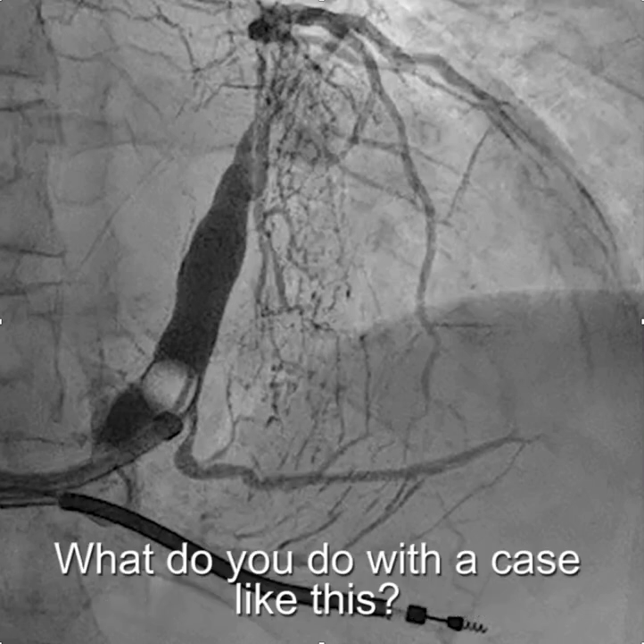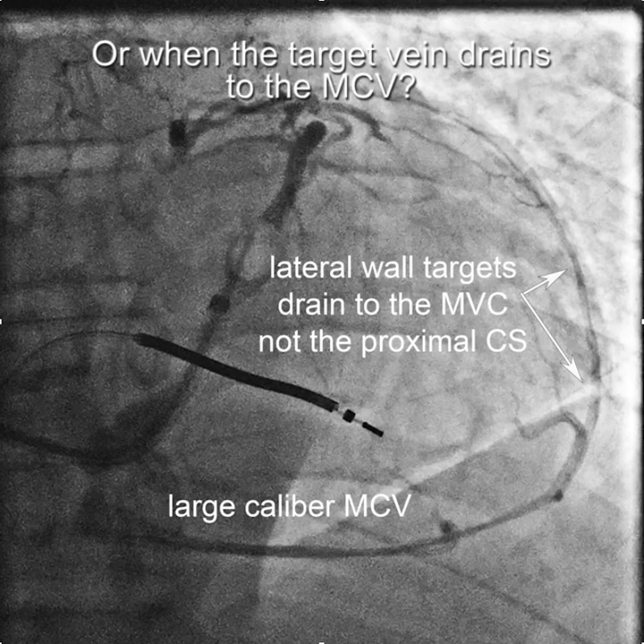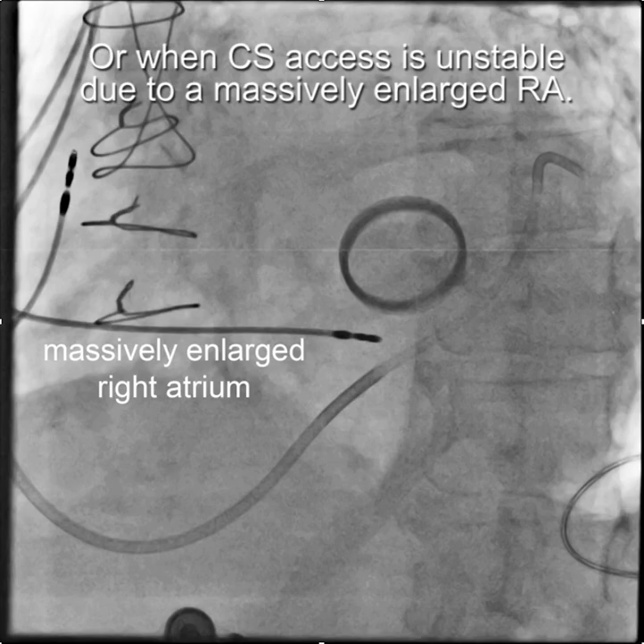Do you ever have a situation where you have a difficult takeoff close to the ostium of the coronary sinus, or a case where the lateral wall target vein is very close to the ostium, or even at the ostium of the middle cardiac vein, or where the lateral wall target veins drain into the middle cardiac vein and you need to get into the middle cardiac vein to implant, or finally a case where you have a massively enlarged right atrium and every time you try to do anything your sheath falls out because it is unstable in the coronary sinus?